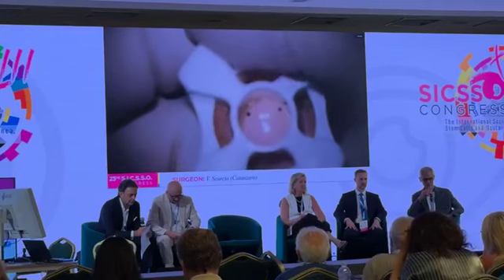But even if you have any perforation, it is very peripheral, so it does not affect the final result of the surgery, because you can put a small bubble of air into your chamber, you can finish your surgery without converting in a perforating procedure. So I think the procedure is almost done, so you don't be afraid of small perforation in the periphery. It's my opinion. I don't know if it's the same of some of you.